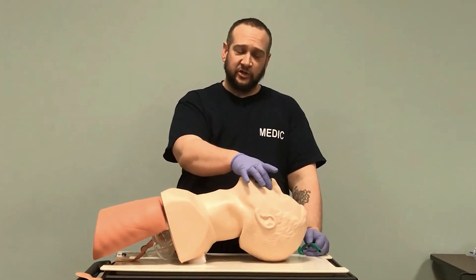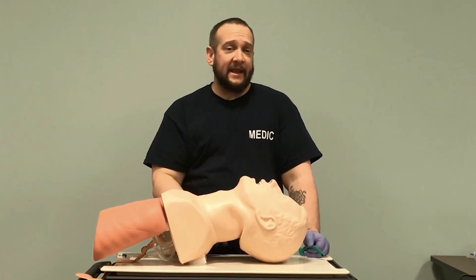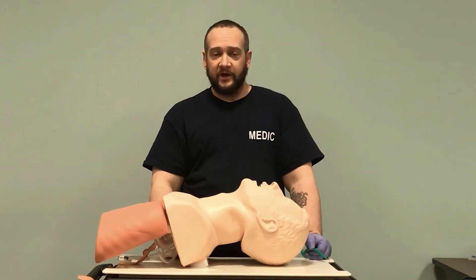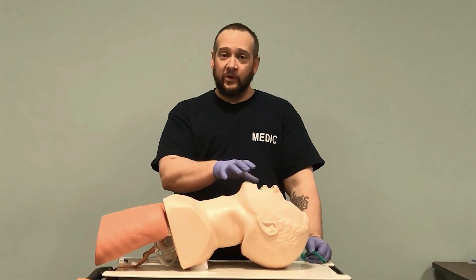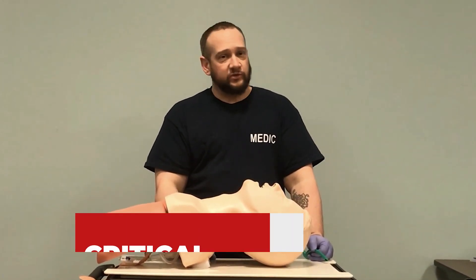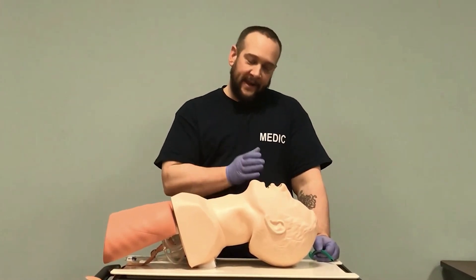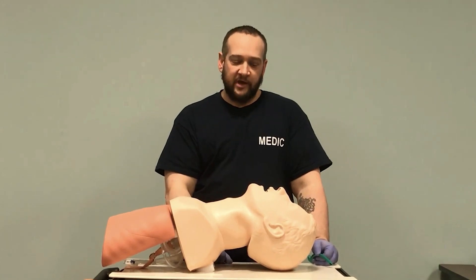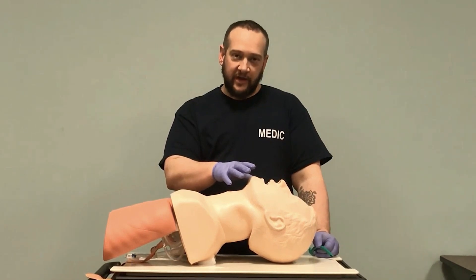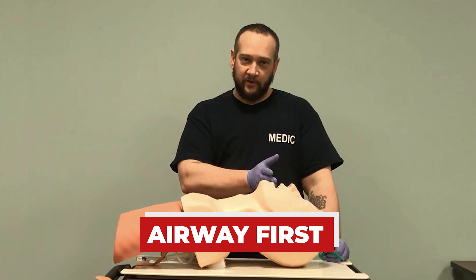Anytime we've got facial trauma, we've got bleeding and multiple contraindications — this is a critical patient. We're going to need a lot of people to help manage this patient, and airway has to be prioritized. If I start ventilating the patient without managing the airway first, nothing I do for breathing is going to help. Airway always comes first.